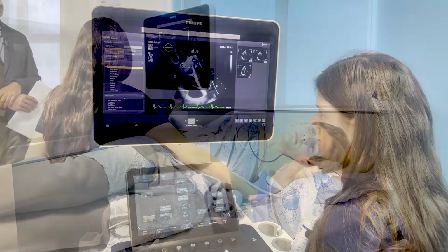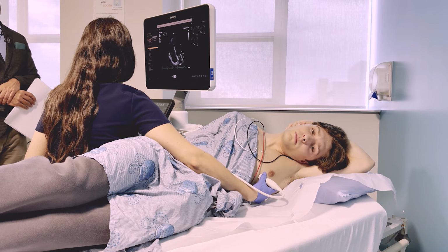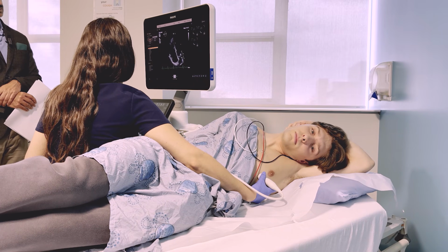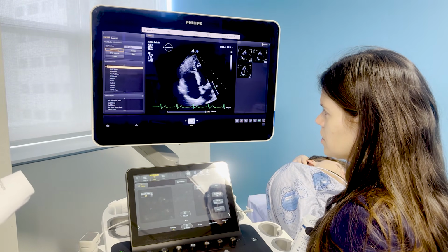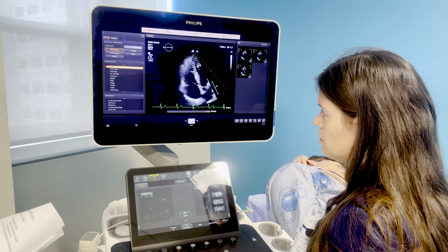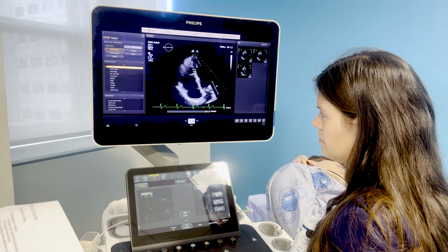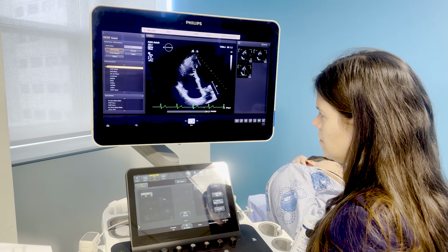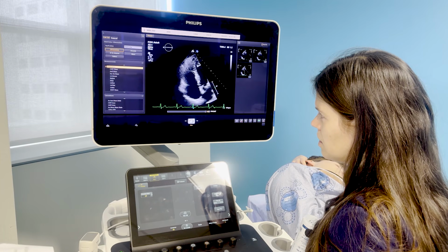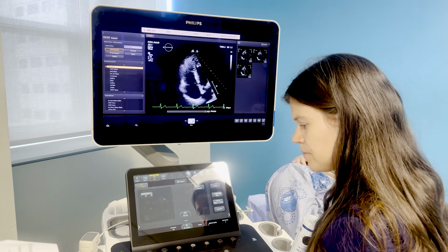Sure. Breathe out again for me, Mateo. Hold your breath. Good, breathe. So I'm just going to cycle back to end systole. RA major dimension and minor dimension, if you can show us. So which cycle I like better, and the tricuspid valve is just closed.